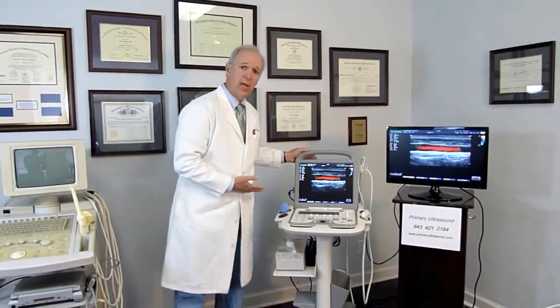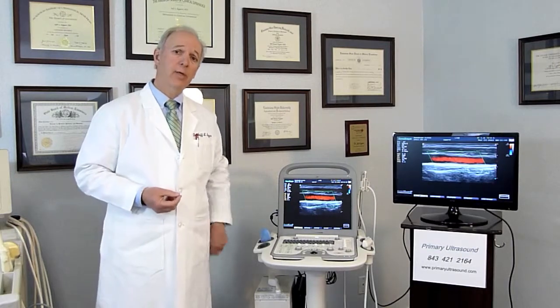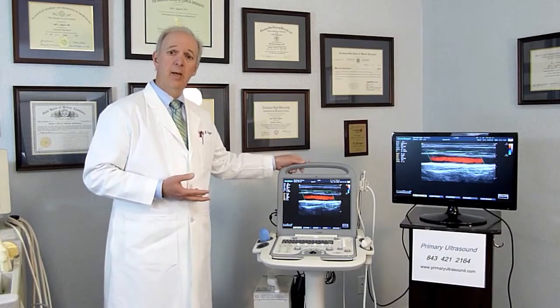Now with the Sonoscape S8, another advantage — in addition to the reliability we see with advances in computer technology and the Linux system — is that it has a two-year warranty, and you can extend that warranty for an additional three years. Manufacturers really tried to keep this affordable. Some cardiologists have told me it may be less expensive to buy a new S8 ultrasound than to pay the maintenance fees on an older console unit.